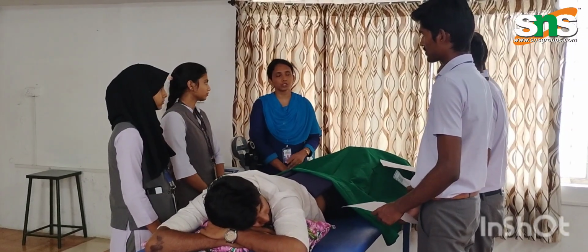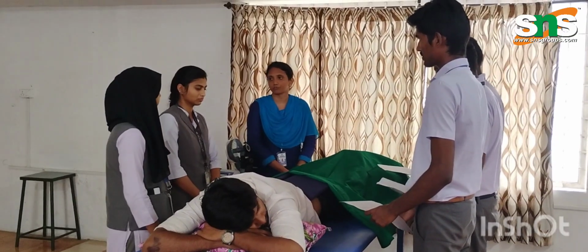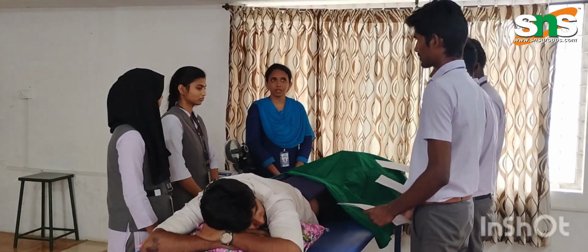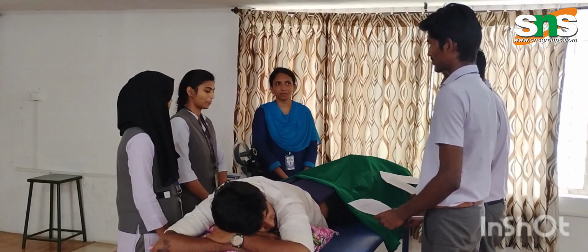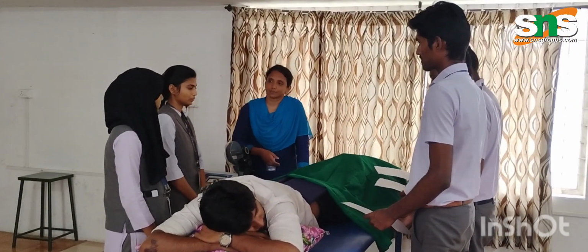According to the visual analog scale, VAS, the patient reported pain of 6 out of 10. So the patient has a moderate to severe range of pain, and we are going to treat it with short wave diathermy. So what is next?